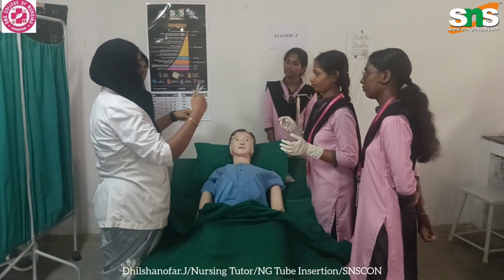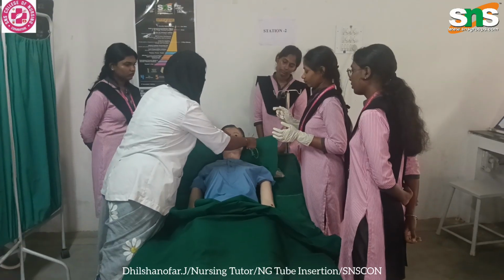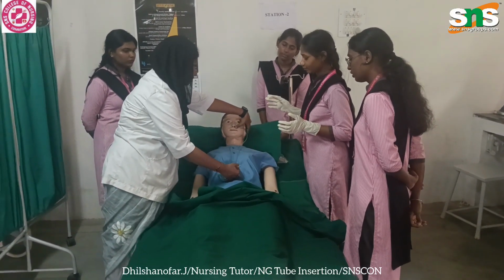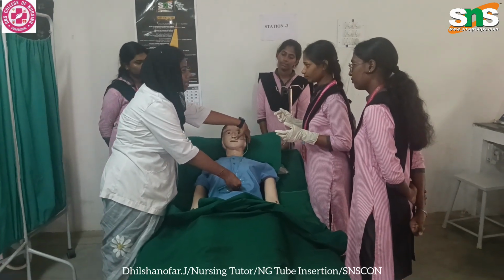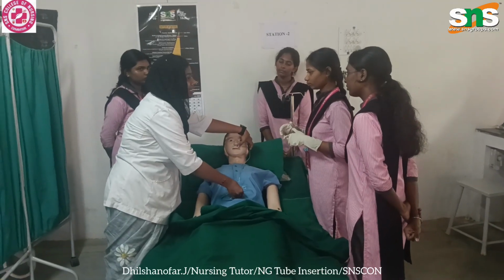You should hold the NG tube like this, from the tip of the nose to the earlobe, from the earlobe to the xiphoid process, which is the end of the sternum. After assessing, you have to mark it with a pen.